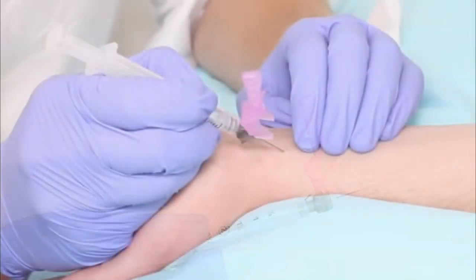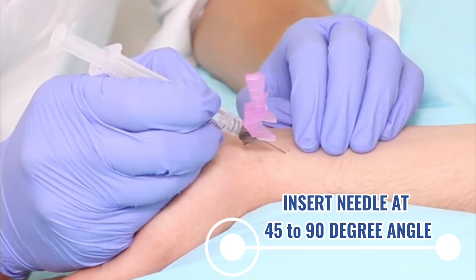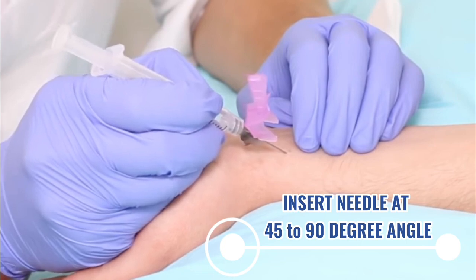Position the syringe needle downward, and puncture the skin at a 45-degree to 90-degree angle.